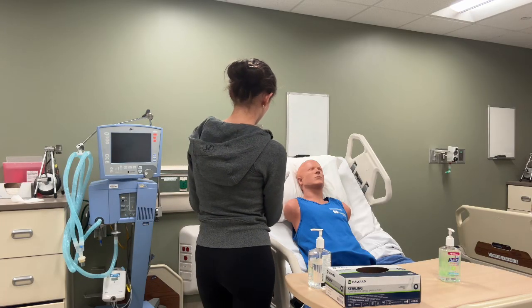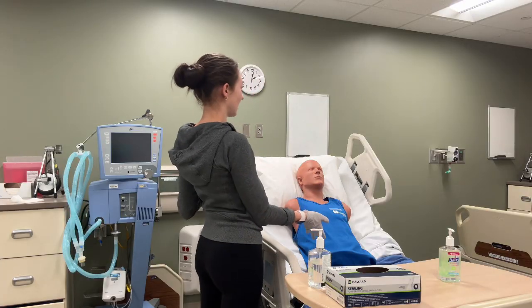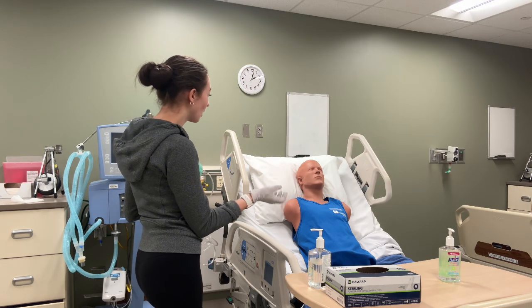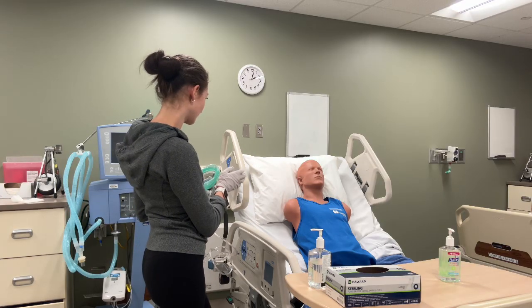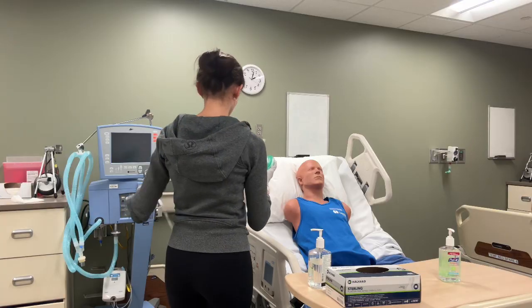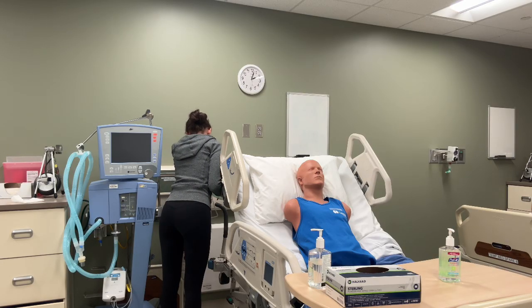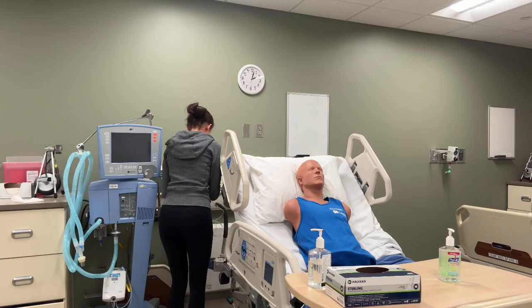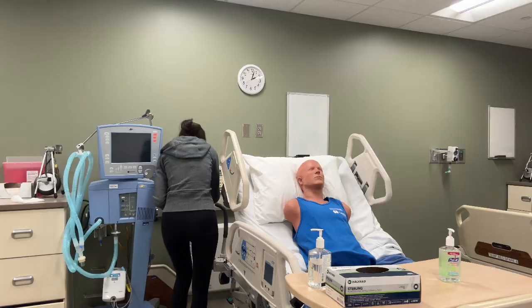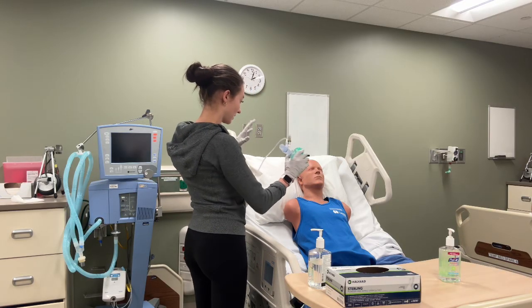What I'm going to be doing is putting this mask over your face while I have some airflow through it — you'll feel some pressure. I'm going to have you take a breath in slightly deeper than you usually would, and then take a breath out — not like you're blowing super hard, but more forceful than you usually would exhale. So, deep breath in and then out against the pressure. I'm going to start it on five to help instruct on how to use this, and I'll have you use that diaphragmatic breathing while you breathe in and out.